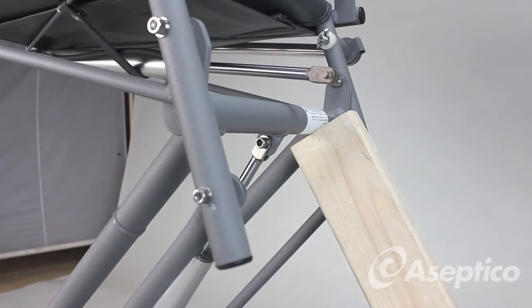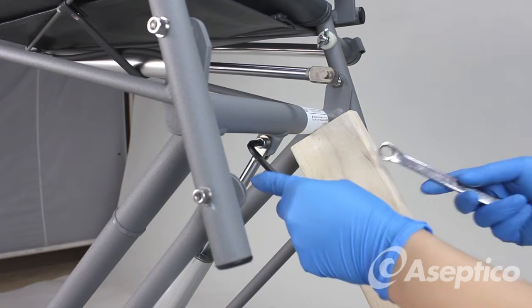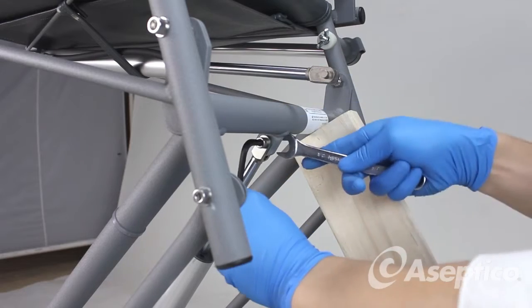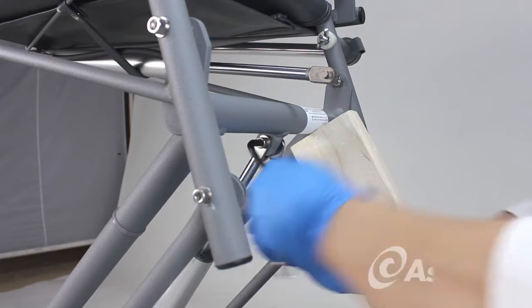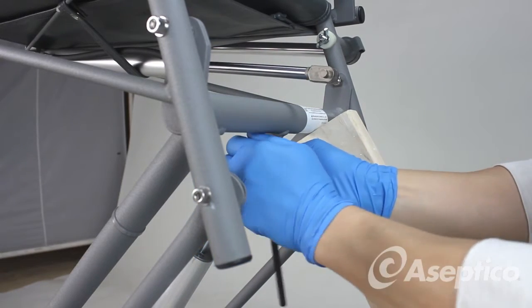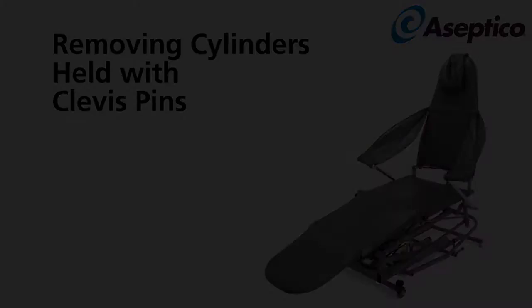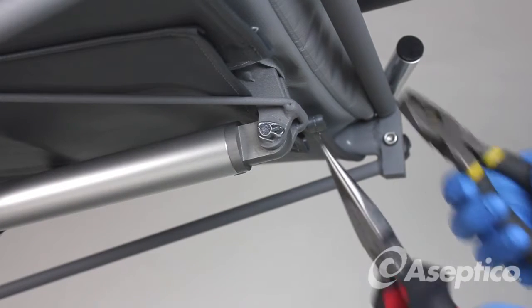For removing the bolt, use a quarter-inch Allen wrench and a half-inch wrench. To remove the clevis pin and the cotter pin, use pliers.